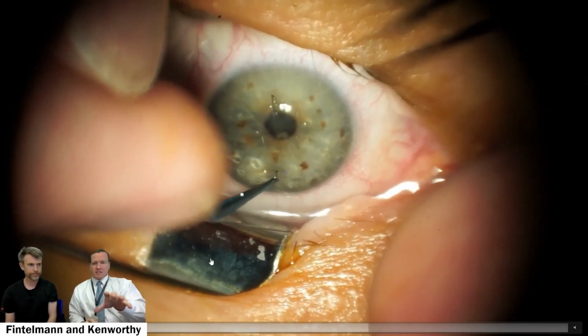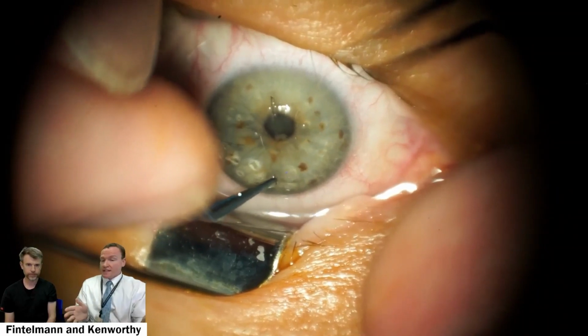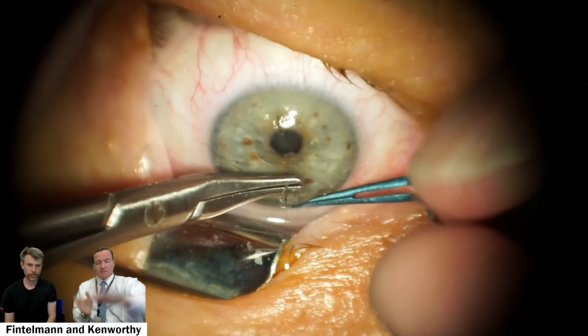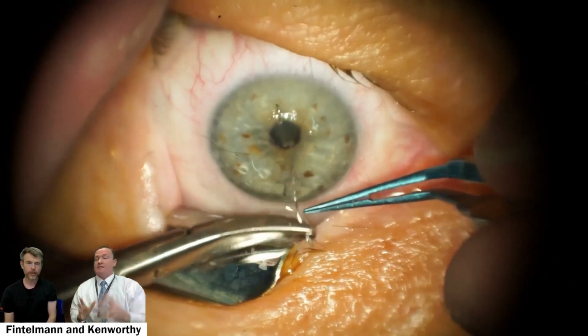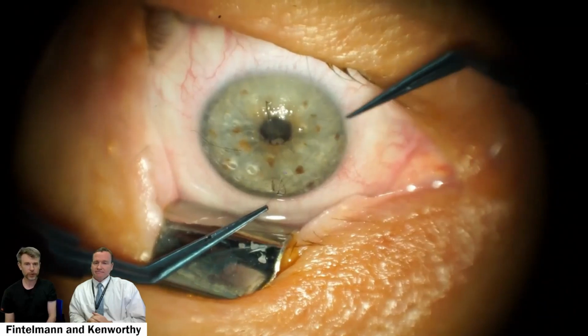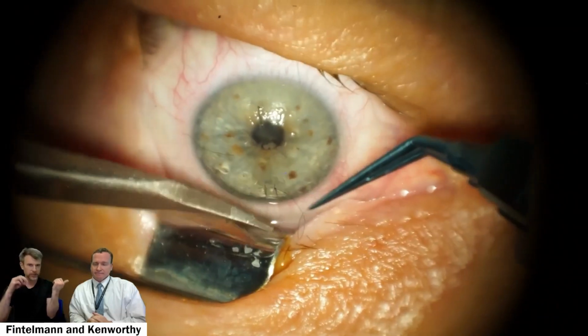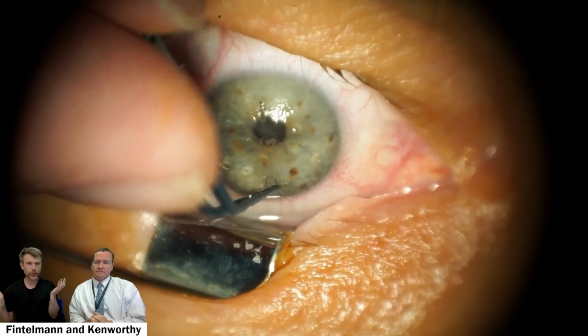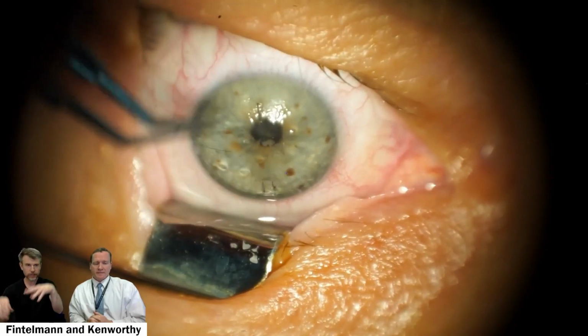Now, as far as these stitches being placed, are they going to stay in forever? How long? Is there another way to more permanently change this, or do you just assume the stitches are in and they're going to be in forever and fix the corneal shape? Well, they'd stay in as long as they don't cause any problems, but ideally at least for 3 months. After 3 months, you get some scarring and some subepithelial fibrosis, so the suture tracks will hold things in place. But if they don't cause problems and the patient sees better, I like to leave them in as long as possible.